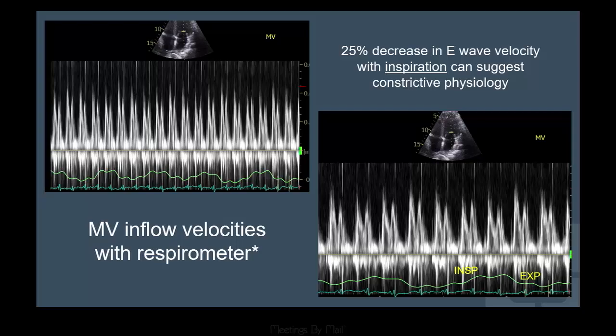A lot of those wires are dangling off the bed, or they're any which way. If you lay that box that holds your EKG on the patient, also have good bone contact with your EKG leads. Some people are very wild with their EKG placements, so make sure that you're on a bone and not on a different area where there's a lot of tissue, and play around with your respirometer settings.